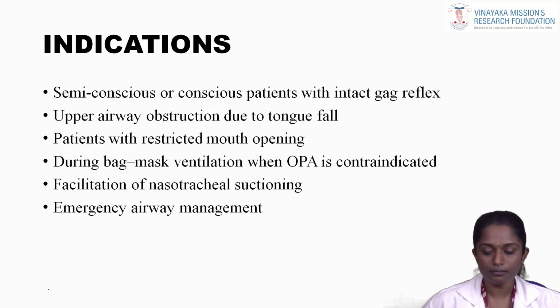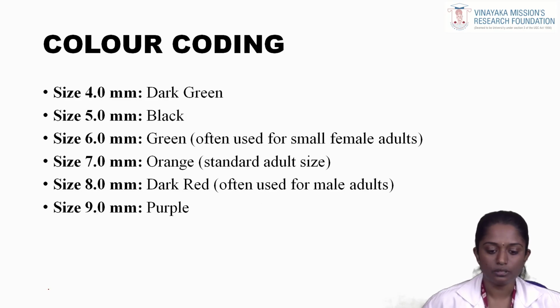Patient with restricted mouth opening during bag mask ventilation when oropharyngeal airway is contraindicated. Then facilitation of nasotracheal suctioning and emergency airway management. In this case, we will use a nasopharyngeal airway. Now we will see color coding. Size 4 mm is dark green and size 5 is black. Size 6 is green, 7 is orange, 8 is dark red and 9 is purple.